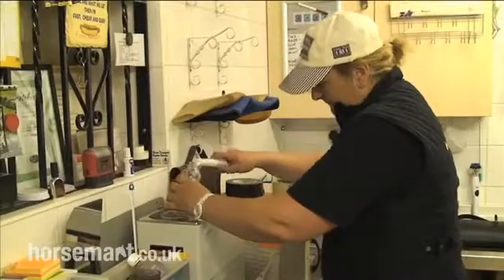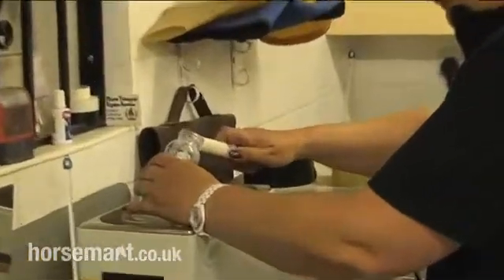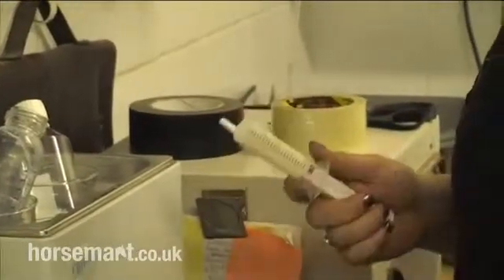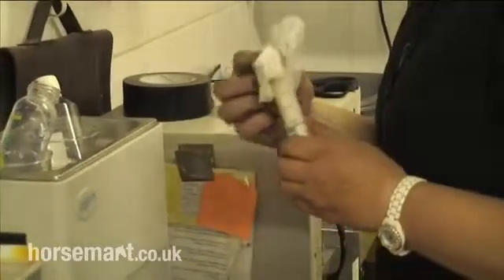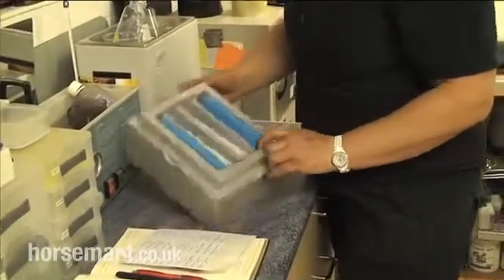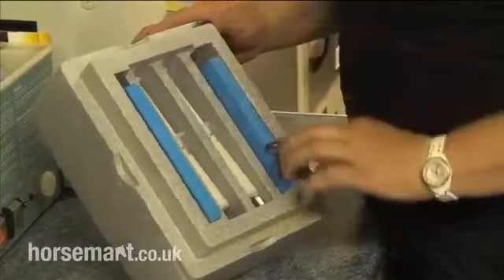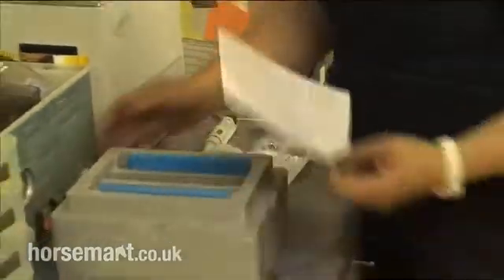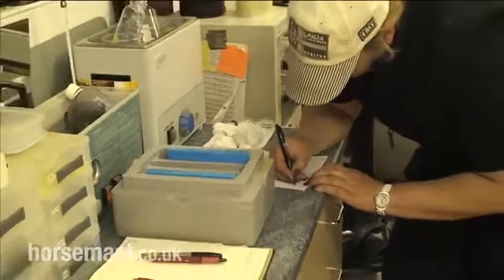Once we've got our ejaculate from the stallion extended, it gets loaded into special syringes. These don't have black rubber plungers — they're called two-part or plunger-less syringes. The black rubber liner inside a standard syringe would actually damage the sperm cells. They get loaded into these special containers — polystyrene containers with chiller blocks. They cool the semen down to about 5 degrees C and it'll stay like that quite happily for 24 to 36 hours.